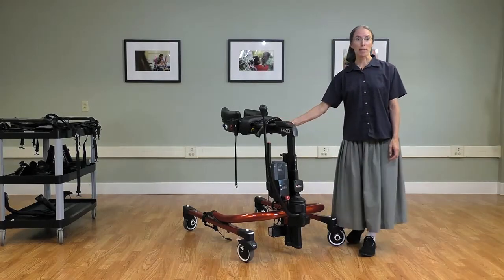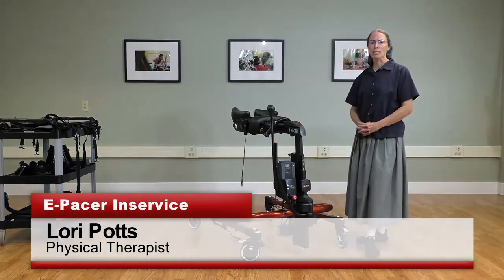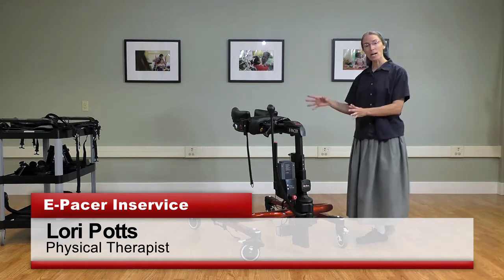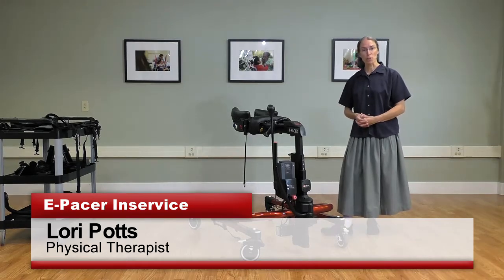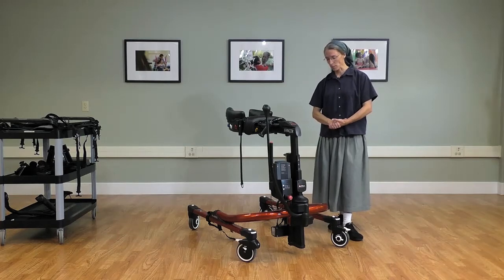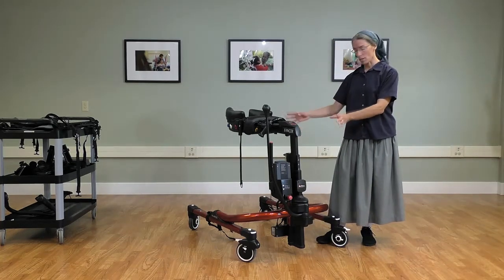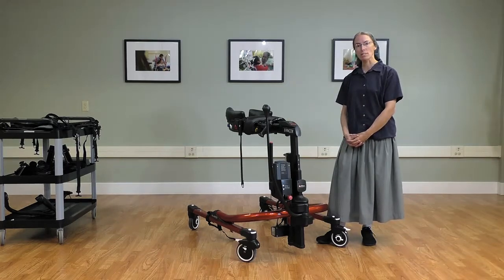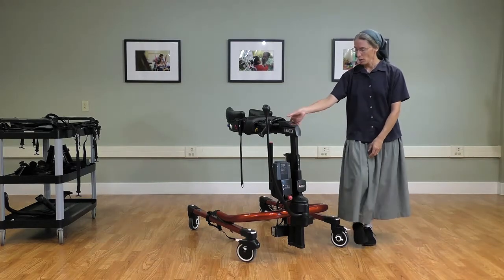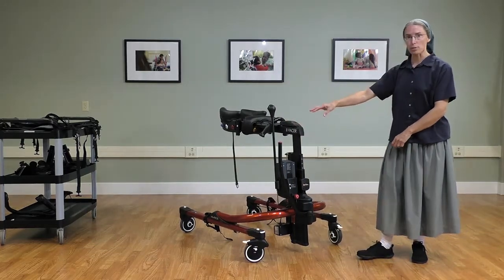This is the Rifton E-Pacer, and the concept with this product is to combine features of the tram and features of the pacer. You will see that the base has the pacer casters and the pacer ankle prompts, and then we have the battery-powered assist lift of the tram.